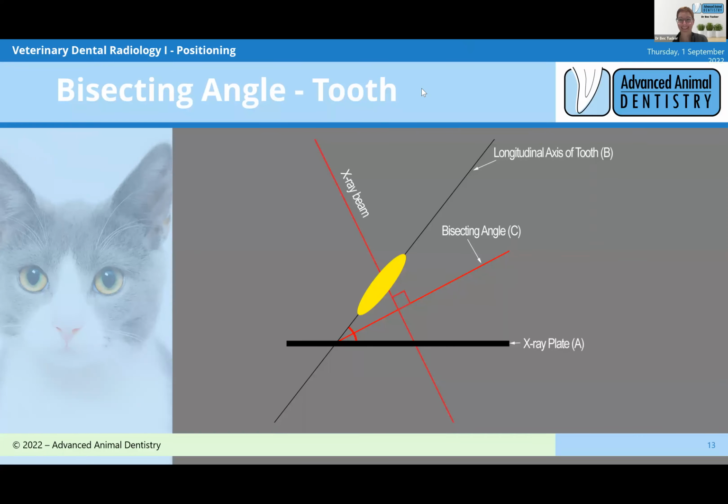Best way to look at them, if they're overlapping, Karen, just take a couple out and then you'll be able to see the one you want. And so we've got this, and we're going to shoot this image, and a beam comes through, and the shadow that tooth is going to cast on the plate when we do that is going to be dimensionally correct.